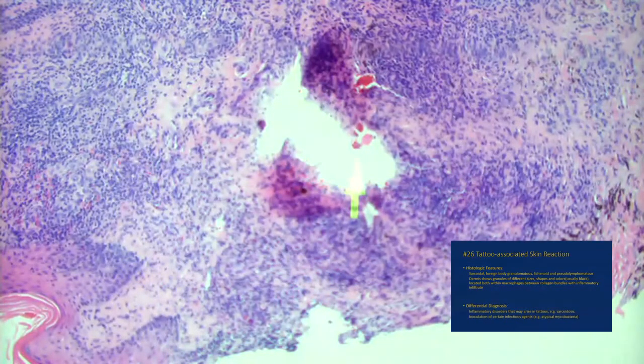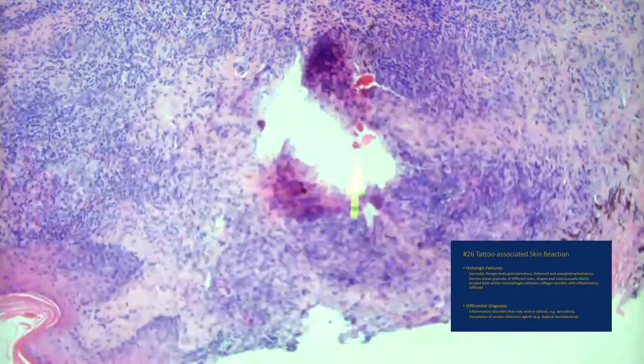And the one thing that you always want to make sure when you get an inflammatory response to a tattoo is that there's not an infection of some sort. So special stains, especially if it's granulomas, to fight that sort of thing. Okay. This one's a fairly easy one.